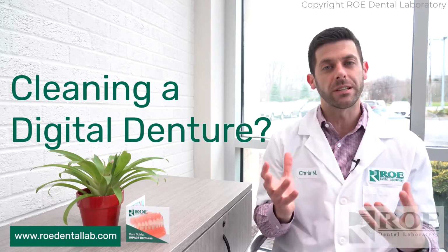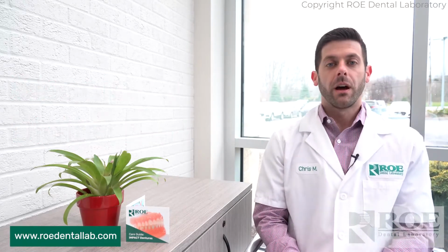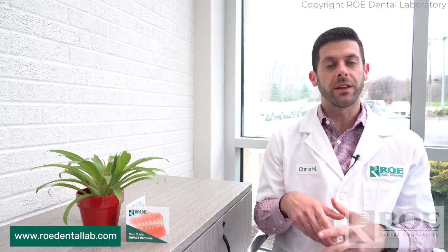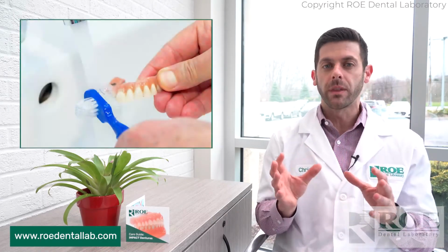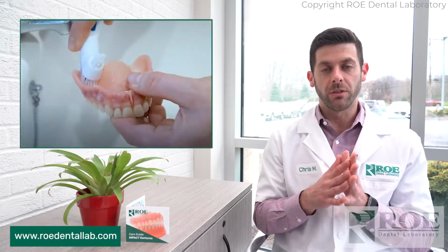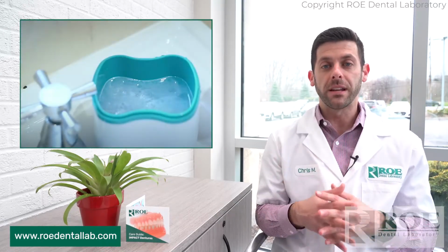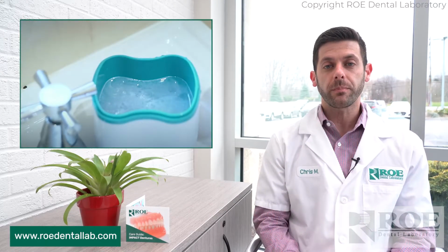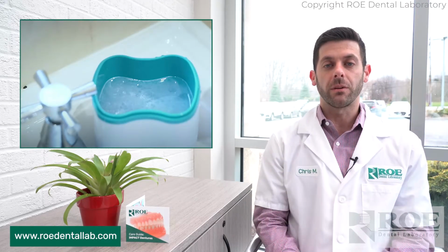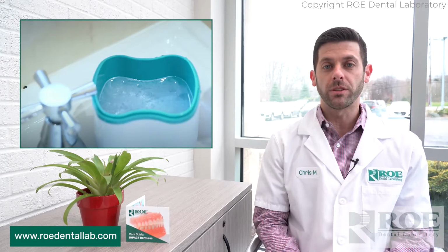A lot of doctors ask us, because it's 3D printed, a little bit different material, so how do patients care for these? So it's very similar to your standard denture, non-3D printed, but on the patient side, just make sure that they remove the denture, they give it a good rinse, just some warm water, and then brush it with a soft bristled brush. So nothing abrasive. You can use a denture cleaner, soak it 3 to 5 minutes in the approved denture cleaner. Once removed from there, of course, give it another rinse with, again, warm water. Very important, you don't want it too hot.